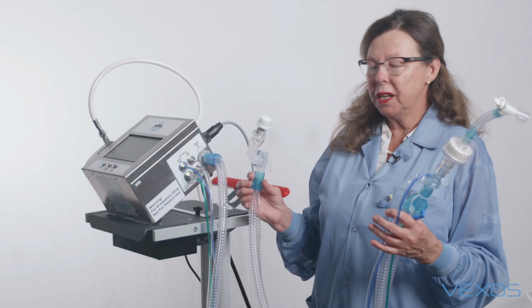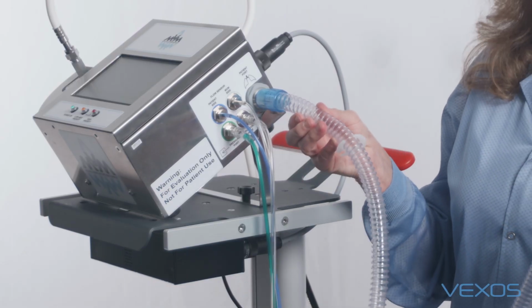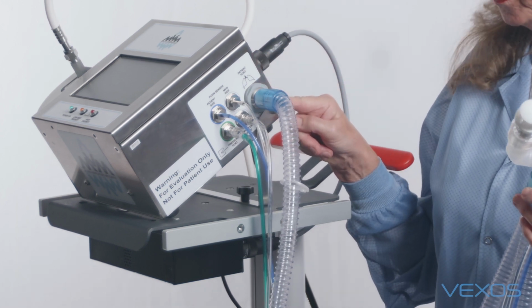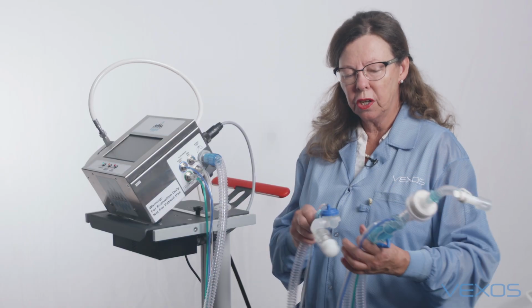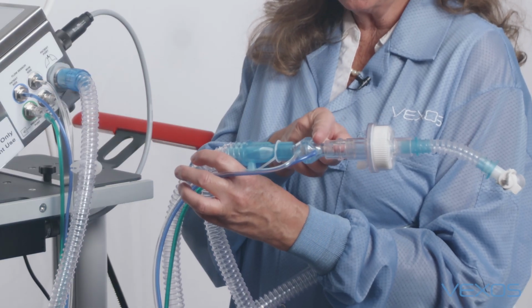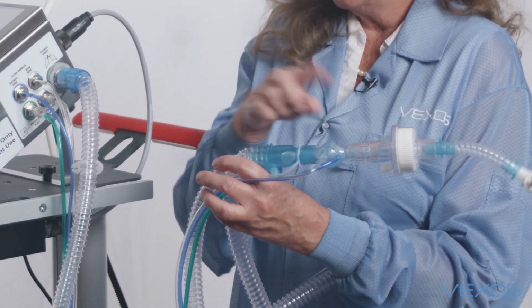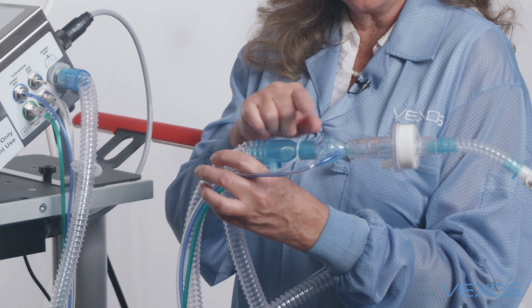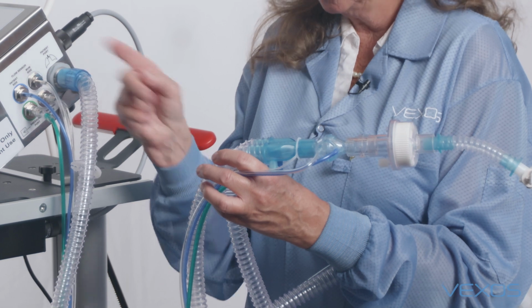The circuit needs to be attached to the ventilator in a very specific way. The long inspiratory limb will be attached to the patient port that is located right here. The flow sensors need to be attached very specifically as well. The blue line corresponds to the blue line on the flow sensor. It's closest to the patient, and it would need to be attached here. The clear line of the flow sensor, the line closest to the ventilator, would need to be attached here.